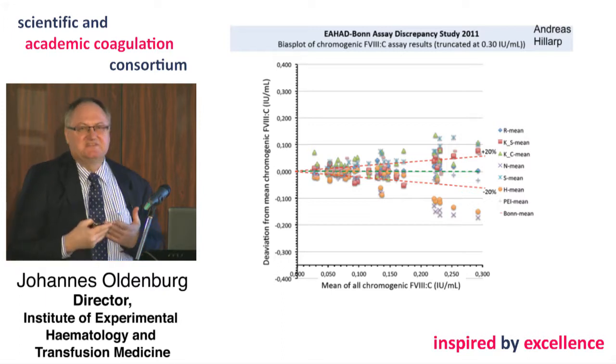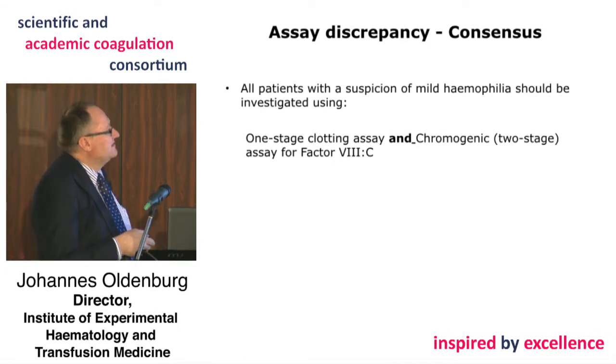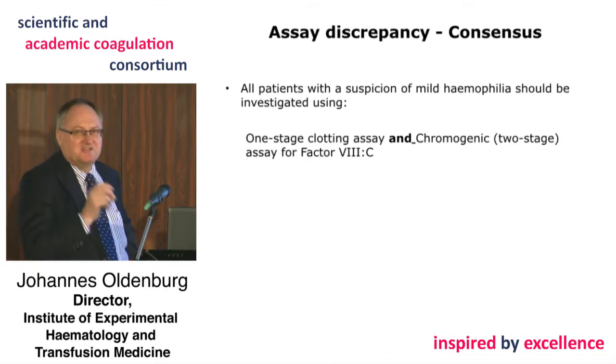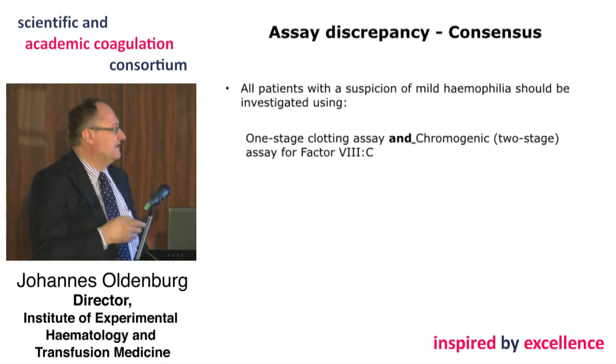So from these results, a consensus was recommended that all patients with a non-severe hemophilia should be investigated for the first diagnosis with both a one-stage and a chromogenic assay.